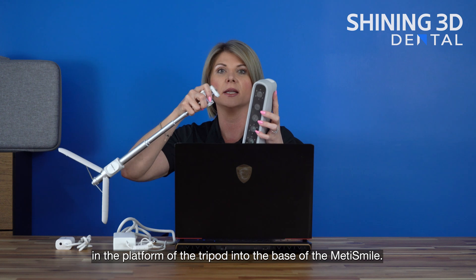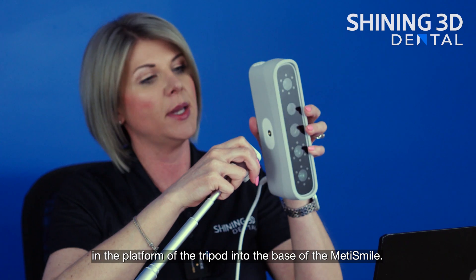We will screw in the platform of the tripod into the base of the MetiSmile.